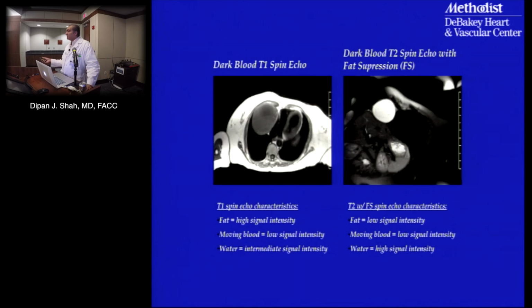It's also long, right? The T2 for water is also long, okay? Therefore the water has slow T2 decay, but with T2 weighted imaging, anything that has long T2 times gives you high signal. Okay, so again, you need to know what T1 weighted imaging does and what T2 weighted imaging does. More importantly, when you look at something and ask what the tissue characteristics are, you need to know what sequence was run.